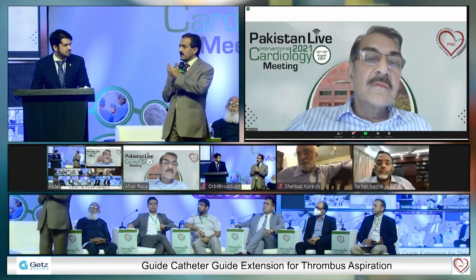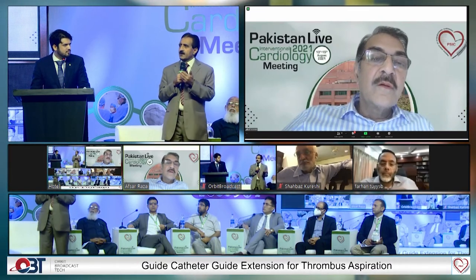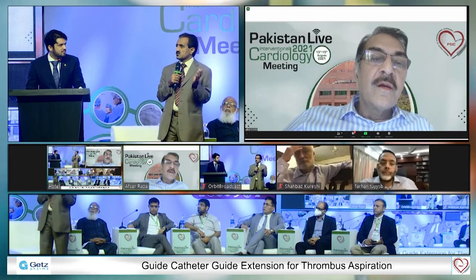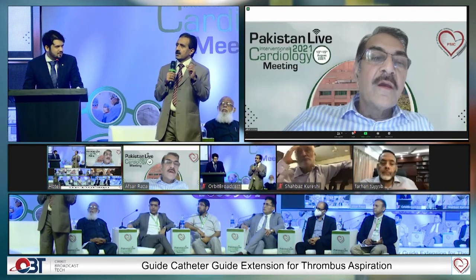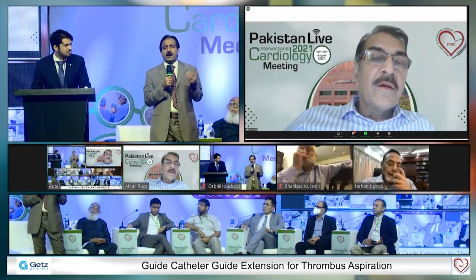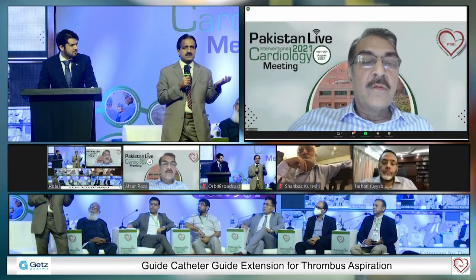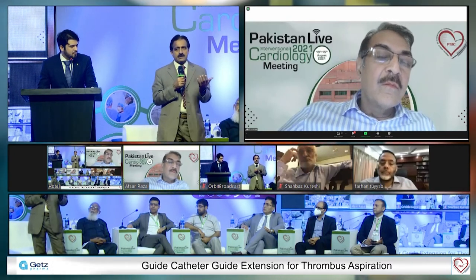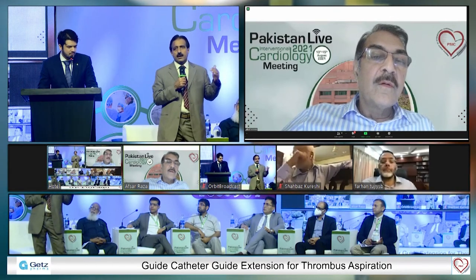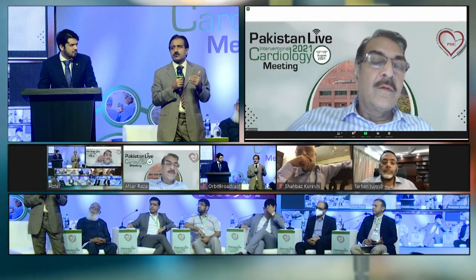The result is very good and excellent angiographically, but the problem is the patency rate in this kind of a graft, all full of thrombus, is very, very small. It's probably less than 30 to 50%. So I would suggest and request that for this kind of patients, unless it's an acute setting, if you can do it, that's very good. But if you can't do it, these cases should be referred to places where they can do it retrogradely and benefit the patient, because probably within a few months, this graft is going to close down again. If you are able to go through this graft retrogradely and open that circ, the results are going to be much better.